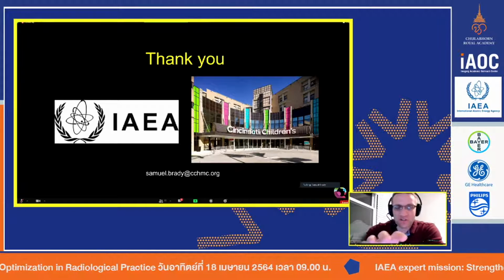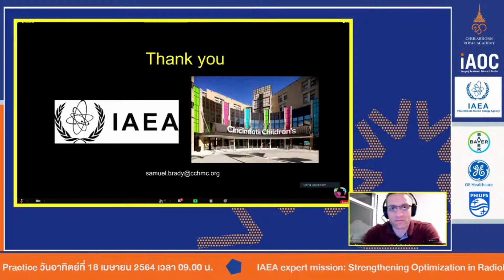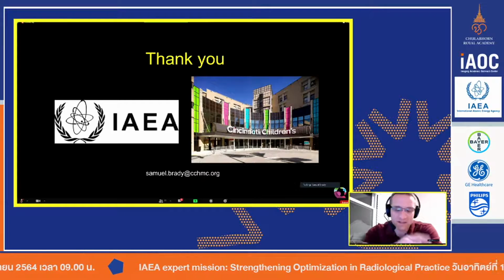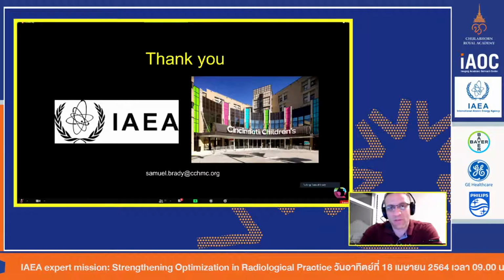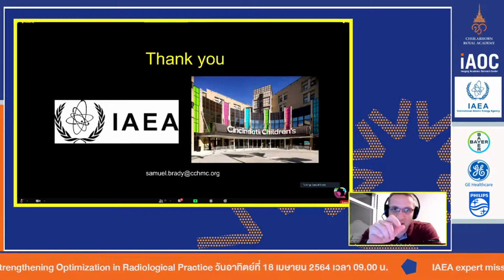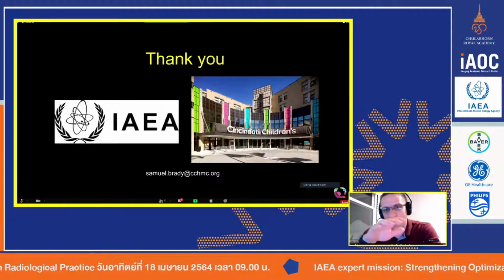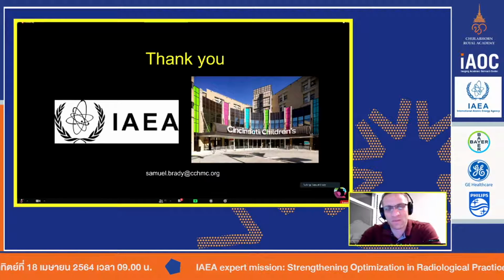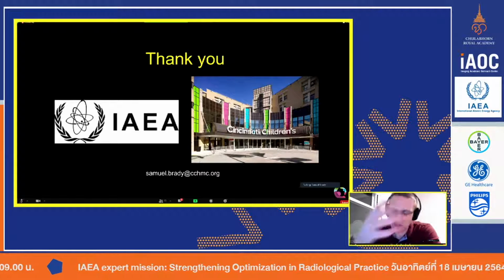When you purchase the equipment, you have your field service engineer that will come in and periodically do their periodic maintenance or PM, not testing, but corrections. If you have a good relationship with them, then you can sit down with them and say, hey, I want the shortest pulse width possible. And they can help you dial it in if possible. And then you can say, hey, I don't want overly aggressive filters for my little kids, because I want to be able to get good, small, short pulse widths, et cetera.